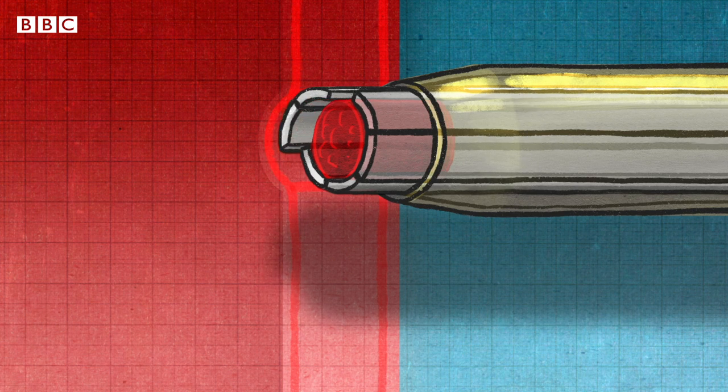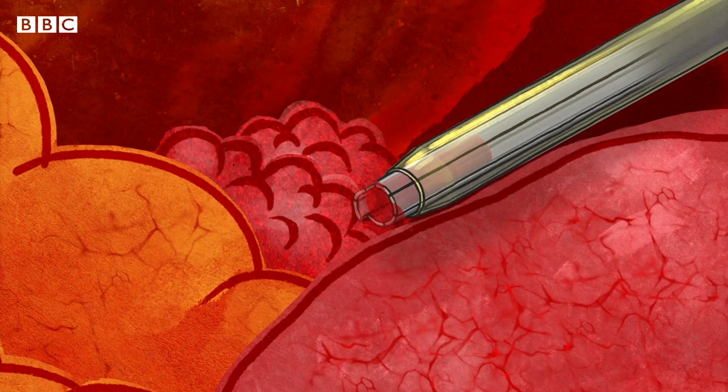Cells are pulled up through the tube using friction by alternating the movement of the blades. And since it uses friction instead of suction, it doesn't get clogged and can reach small spaces.